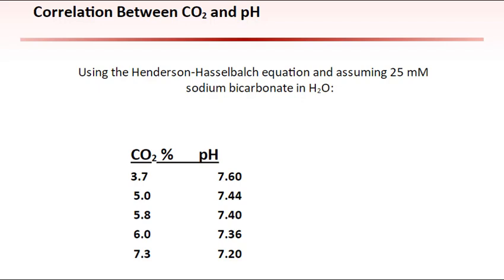In the clinical IVF laboratory, most use media manufactured and QC tested by various companies. Not every company uses 25 millimolar sodium bicarbonate in their media. The addition of protein supplements, such as human serum albumin, will change the pH. Therefore, it is imperative that laboratories measure pH in incubators using the media they will culture their embryos in, rather than rely on the pH as indicated by media manufacturers. Furthermore, pH in the bottles as they arrive from the manufacturer is clinically irrelevant, as no media should be used without equilibration. Therefore, the only clinically relevant number is the pH of the media after equilibration.